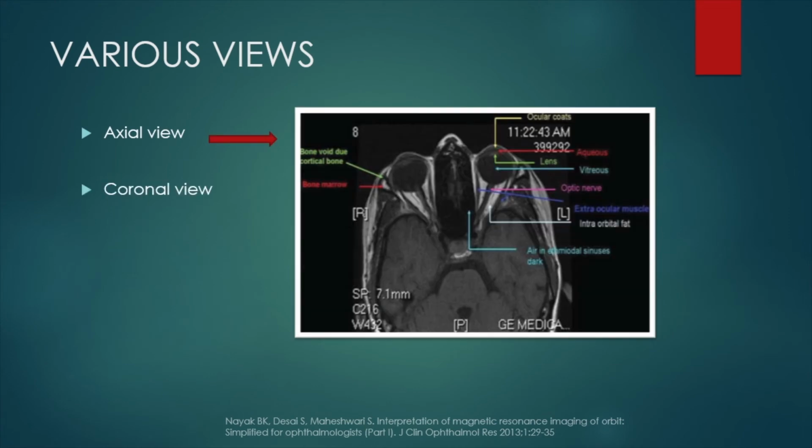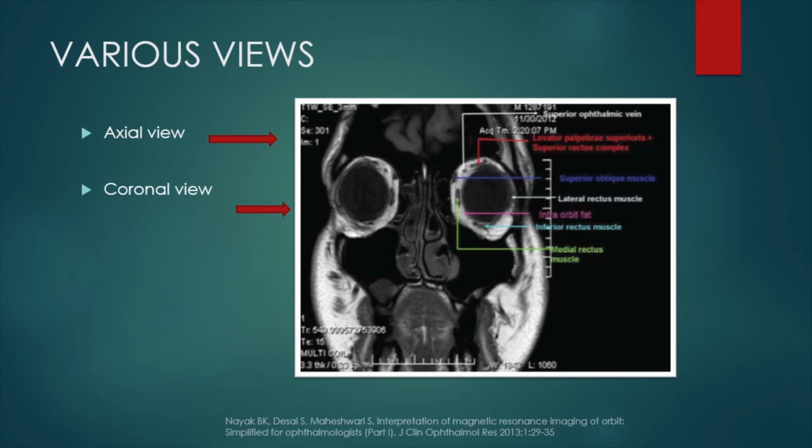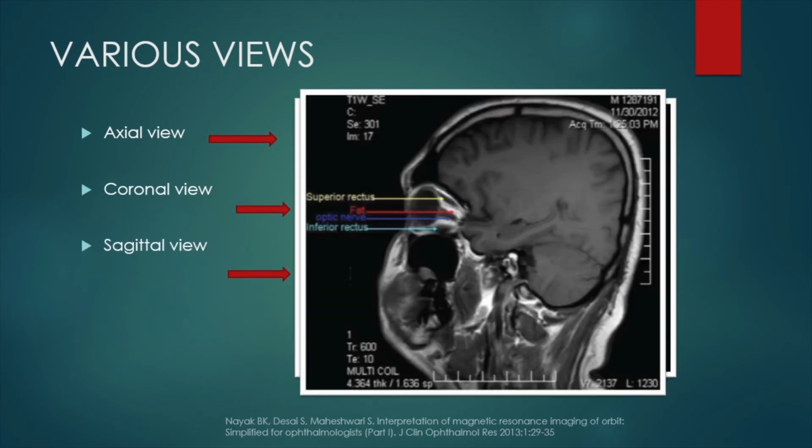This is the axial view, the coronal MRI view, and this is the sagittal view.